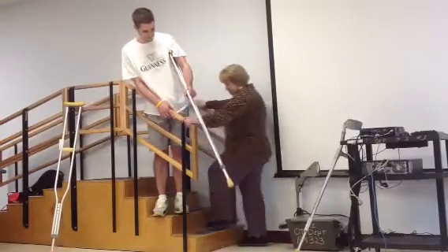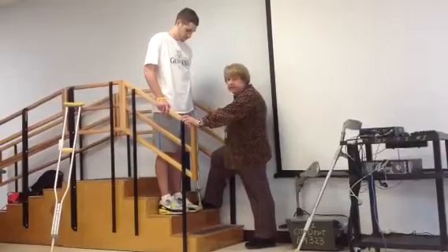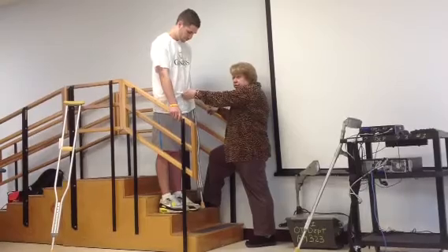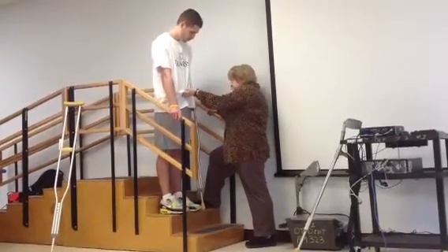So coming back down, I'm going to be on the step below the step that he's going to, and I'm going to hold on to the pelvic band here.